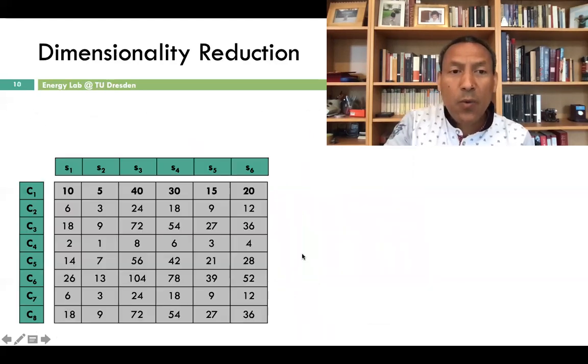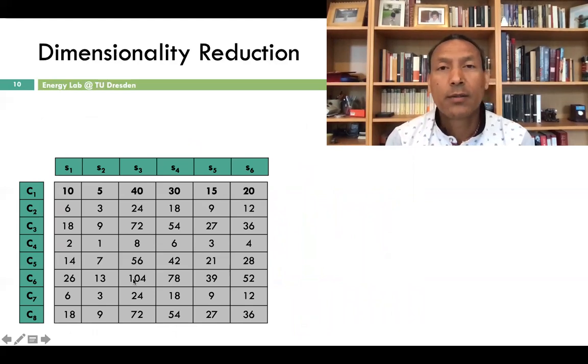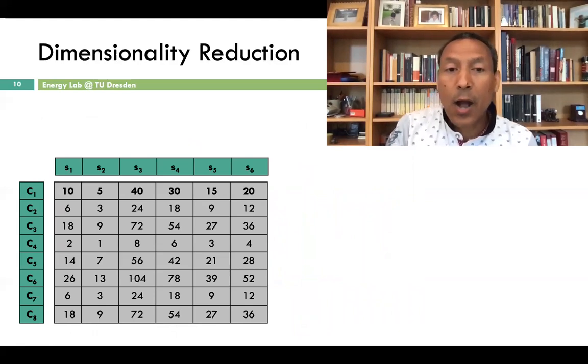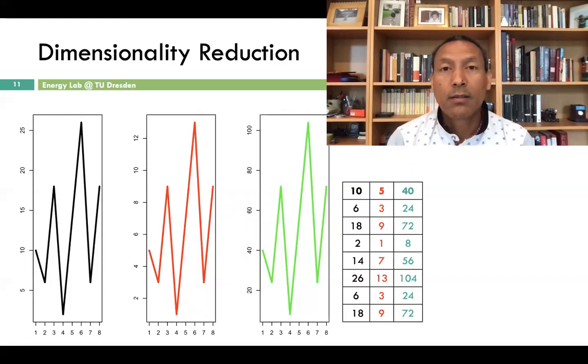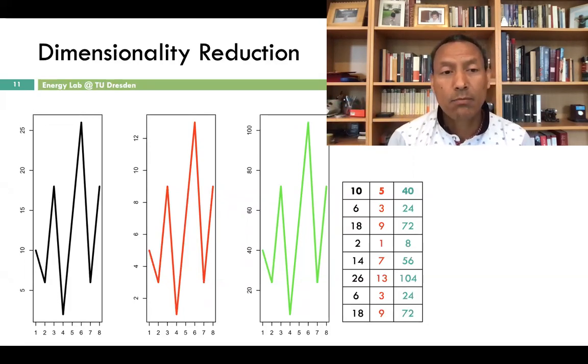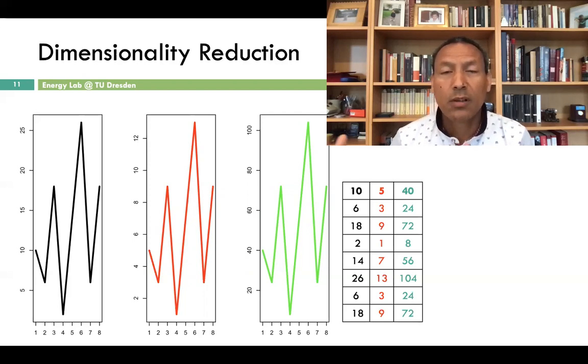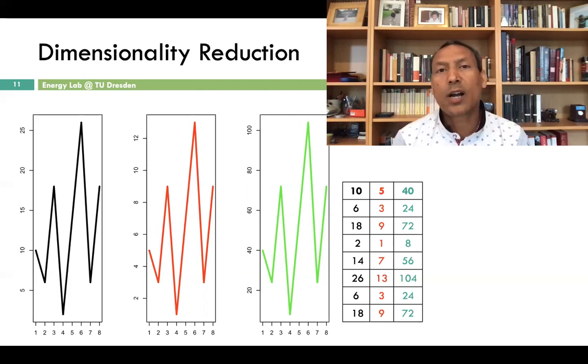So what we were not able to see here by merely looking into the raw data, now we could see the data actually represent one and the same thing. At least the way the things change in time seem to be just the same. So instead of just looking at different columns, it would be sufficient just to look at one column.